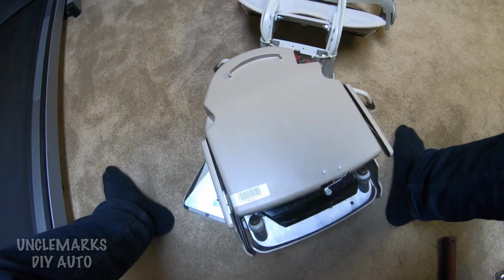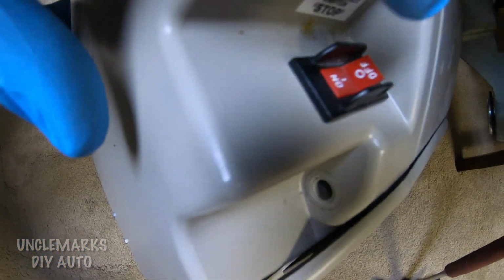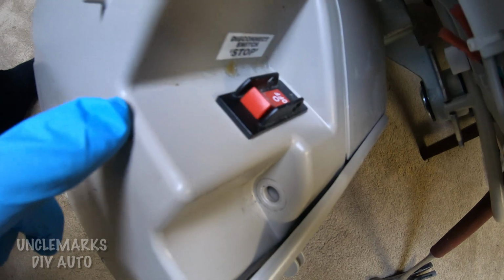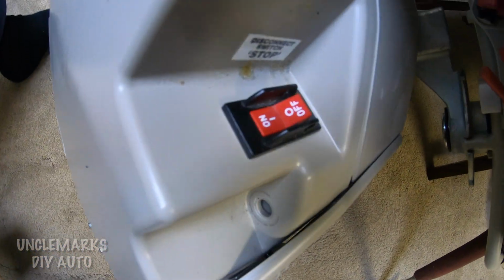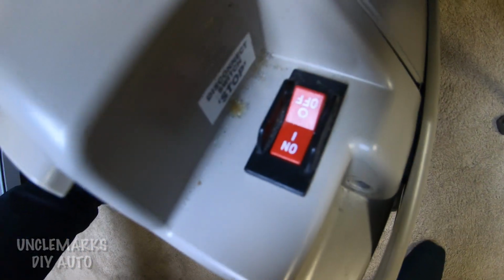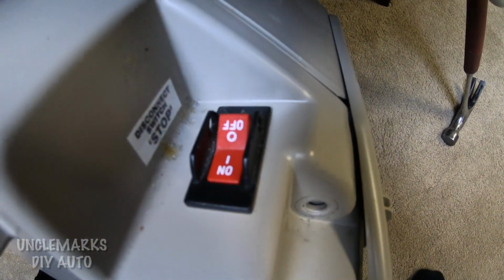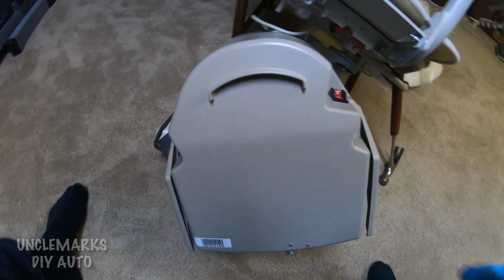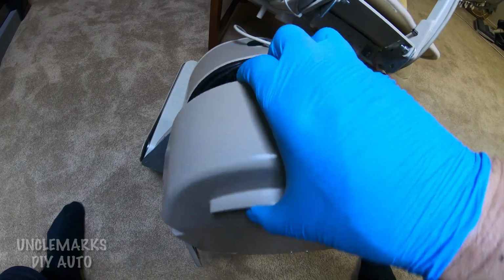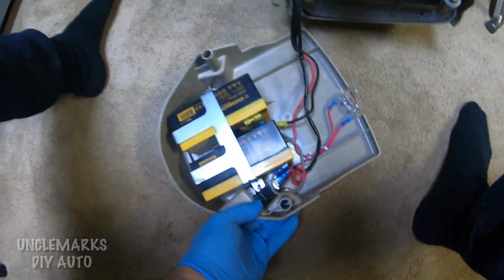And I imagine this cover has got a wire also on it because of that micro switch at the bottom. And we showed you this switch here, off on. I guess you'll want it off. We really should have your unit unplugged too while we're looking at this. So let's go back to the back. As with anything, you want to make sure that you're safe. Now these are low voltage. It's two 12-volt batteries. There's your batteries right there if you need to replace them.